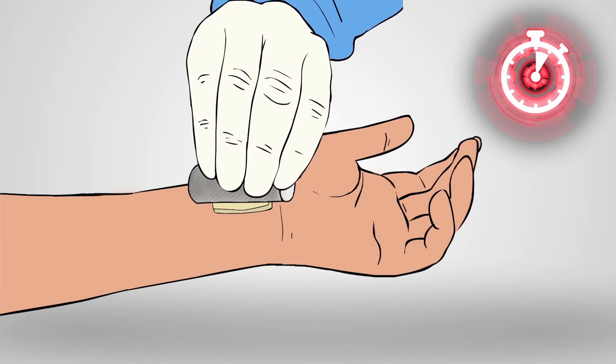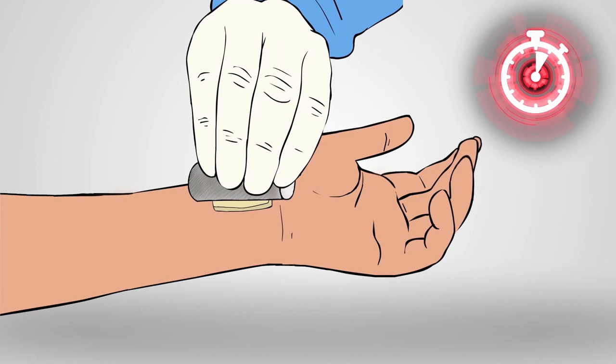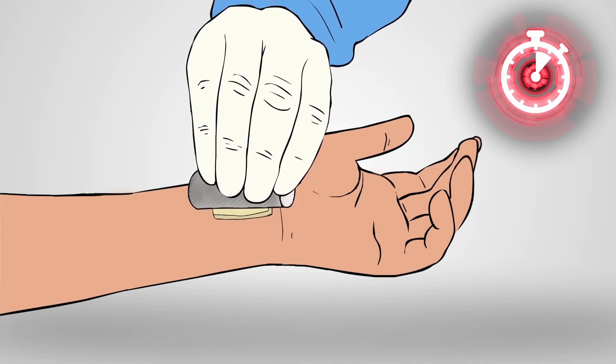Now release pressure and without lifting Axiostat, observe for peripheral bleeding or hematoma formation. If required, apply pressure for an additional 2 minutes and repeat the process.